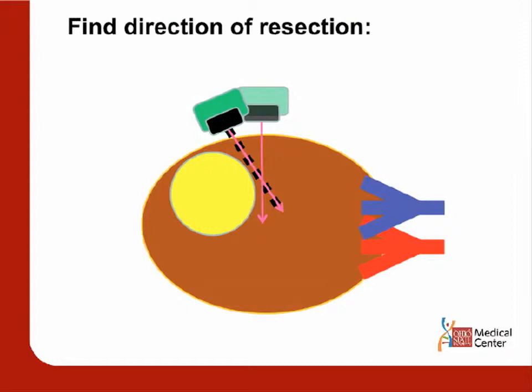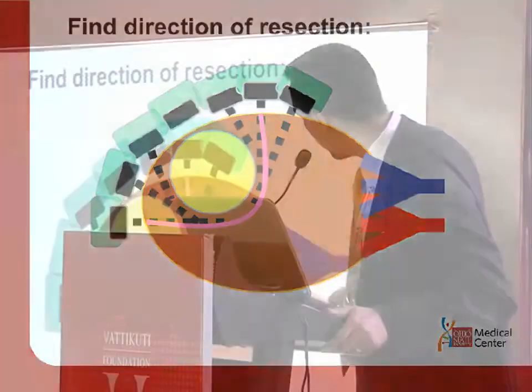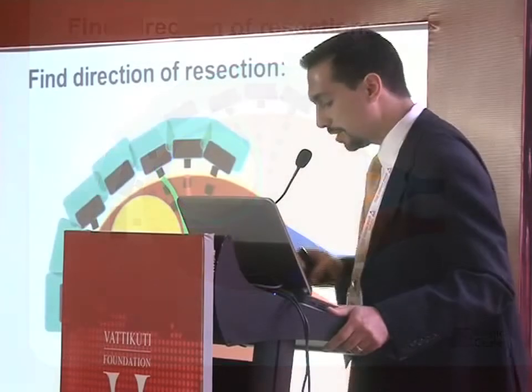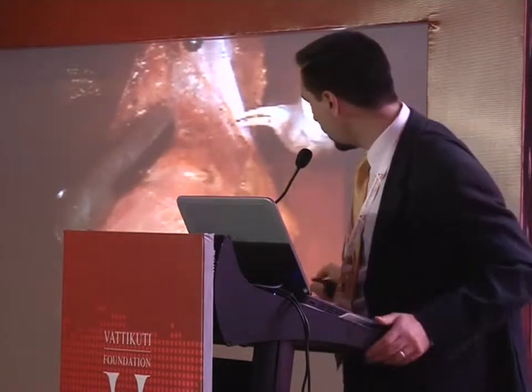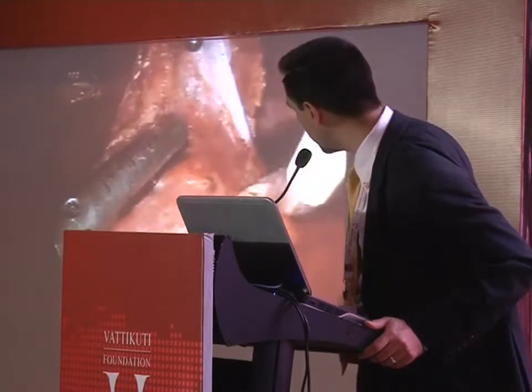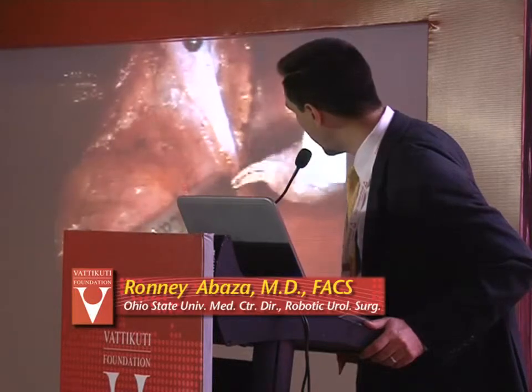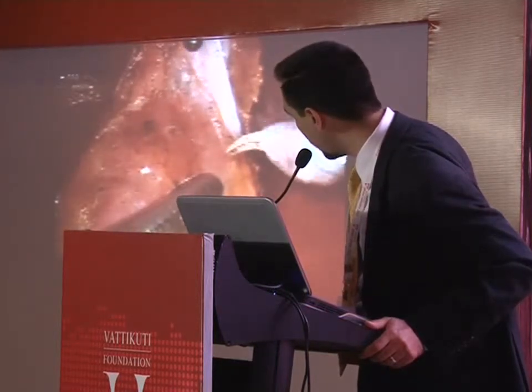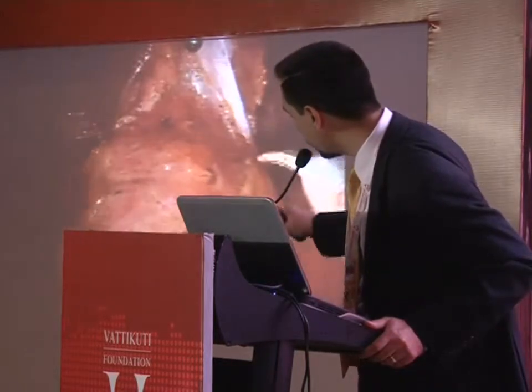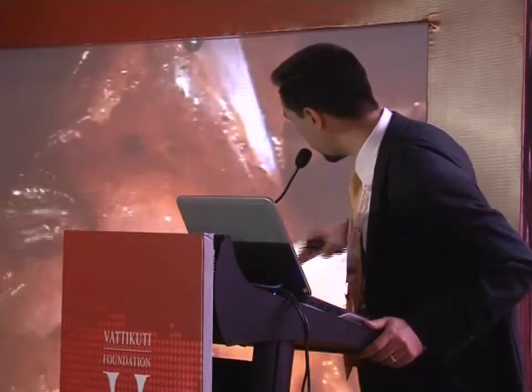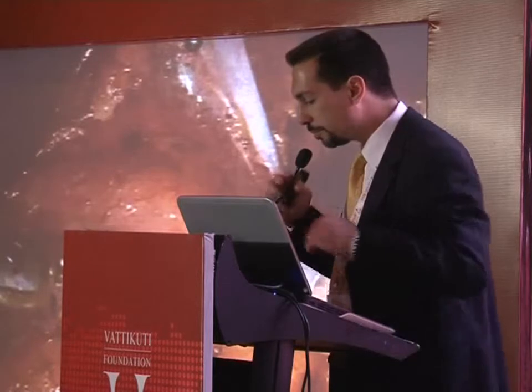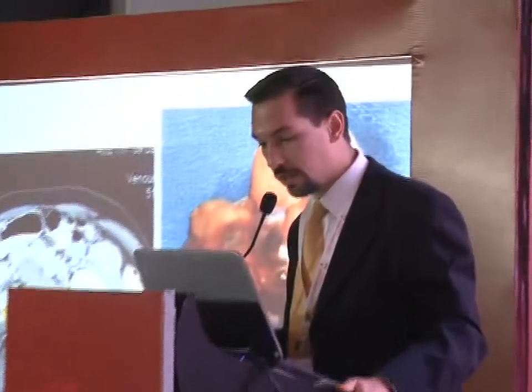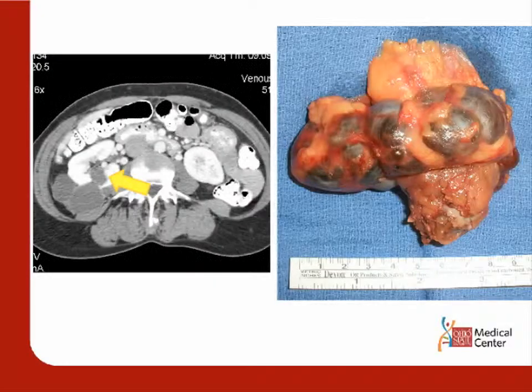With sweeping and rotating, you can figure out exactly where to cut so that instead of cutting way out and wasting kidney, you can do a much more tailored approach and save more kidney. This is true not only for completely endophytic tumors, but for any tumor with an endophytic component. Here's an example of a complex cystic tumor with a completely endophytic component. If we cut into the cyst, it will leak — and if malignant, you'll have cancer cells everywhere. The ultrasound allows us to tailor the resection as much as possible.